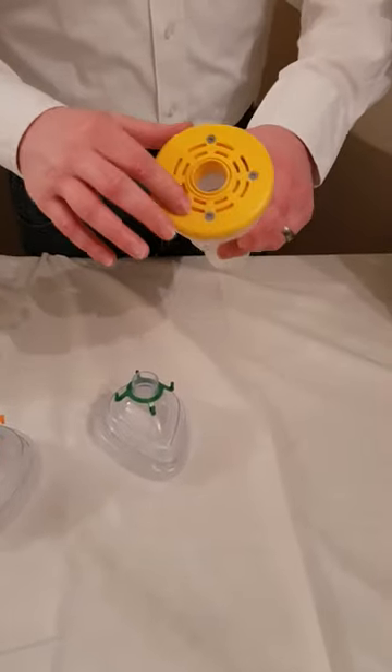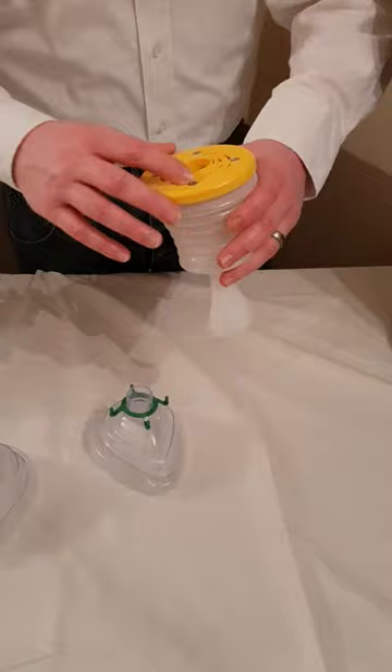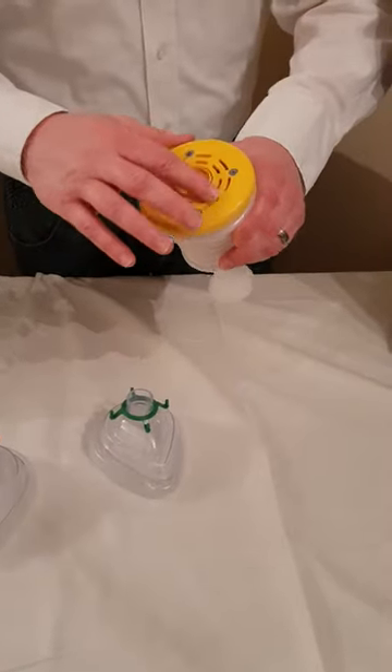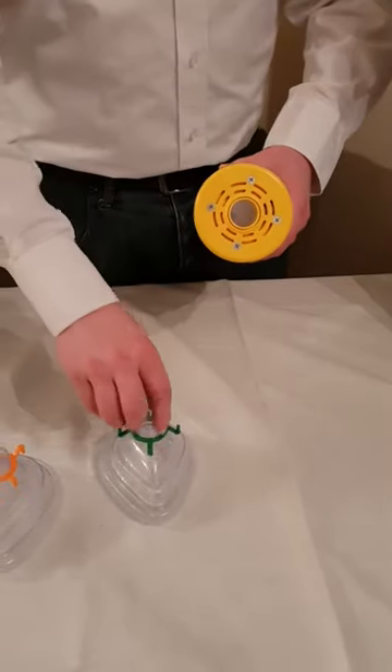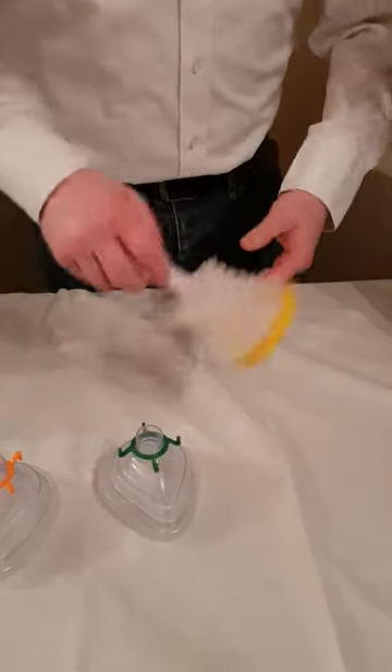Same as before, there's a one-way valve. This means when you depress LifeVac, all the air is expelled through the valve and through the vents, not through the mask. When you pull, the valve closes, creating a one-way suction through the mask.